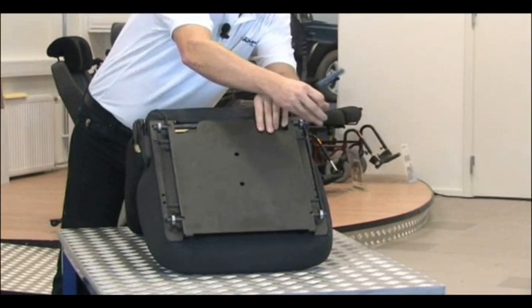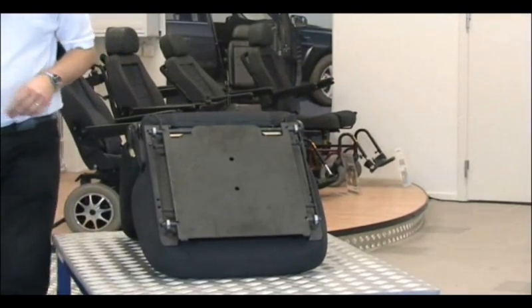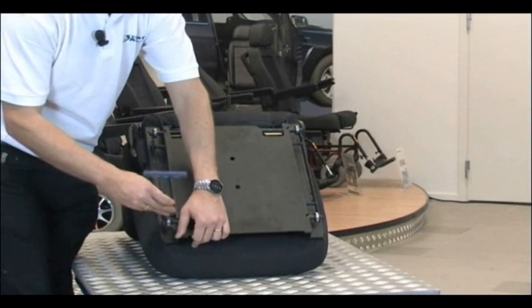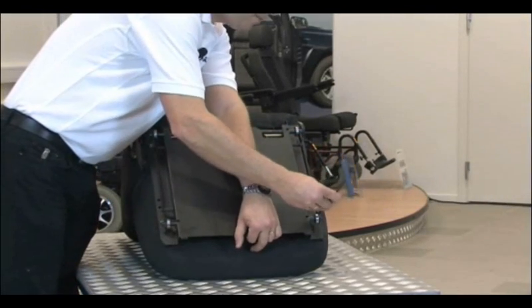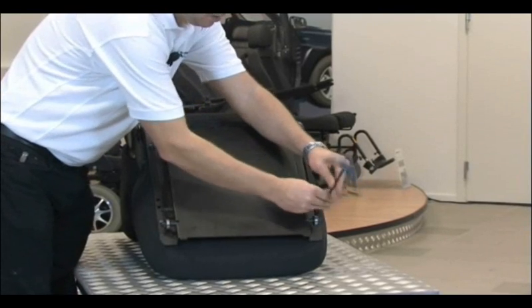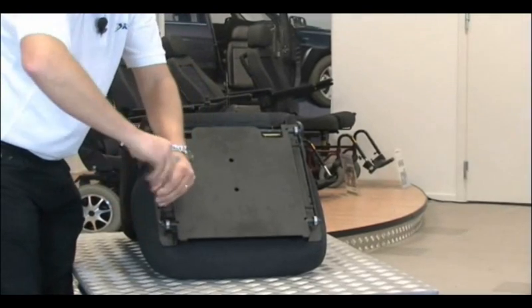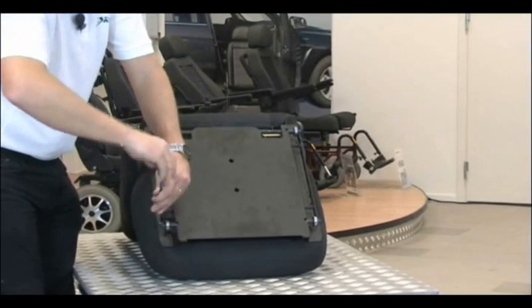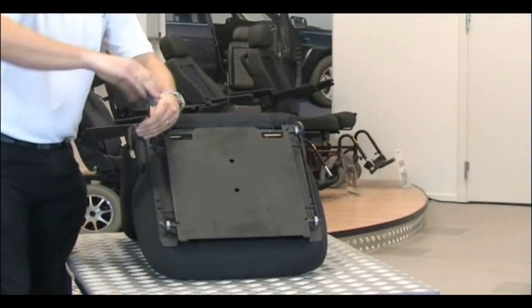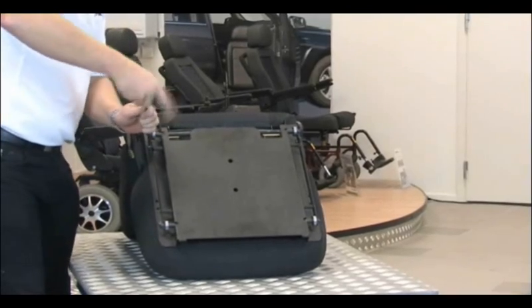Take one at a time, make sure it got the threads all right. No misaligned threads, because that will hurt the seat, and it is quite hard to repair a seat with a damaged thread. So take your time. Make sure it goes nice and easy without any disturbance in the threads. When you have tightened them a little bit, you can do the finishing touch by just tightening them hard enough.